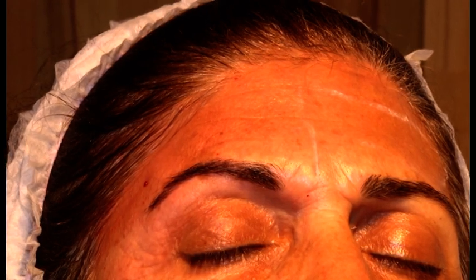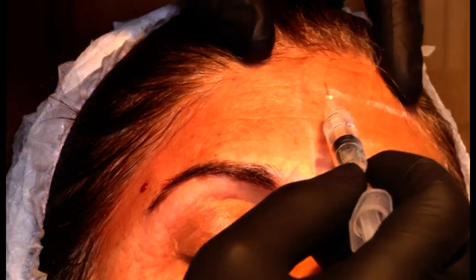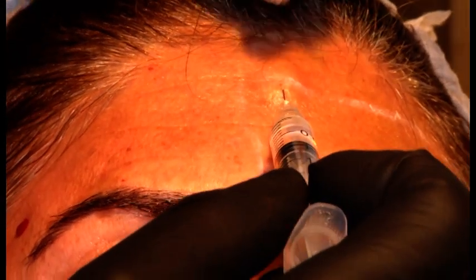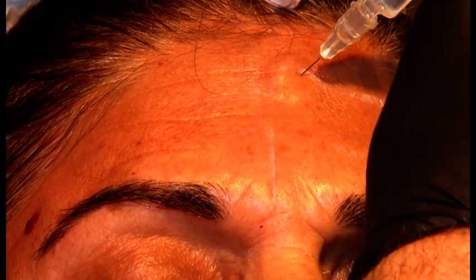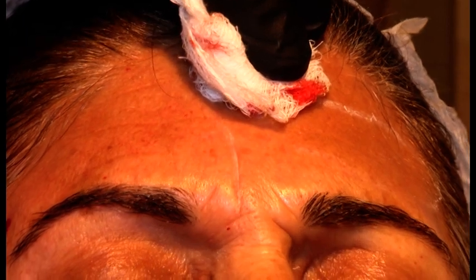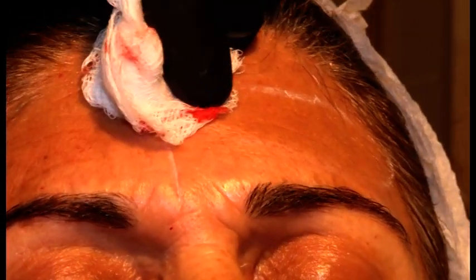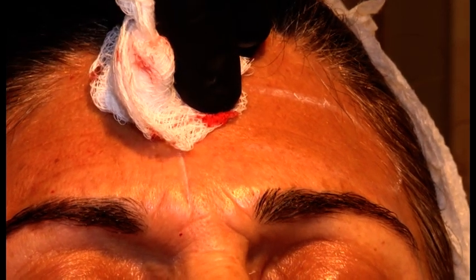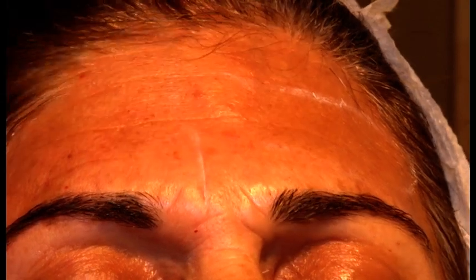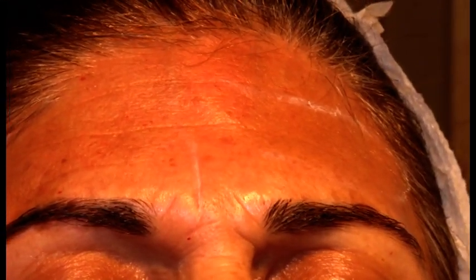Now, medial entry point. Again, a little bit of anesthesia right here. Thank you. And actually, maybe it's easier if I stand. Can I have the needle? The entry needle? Thank you. Maybe can I stand behind here? Not really.